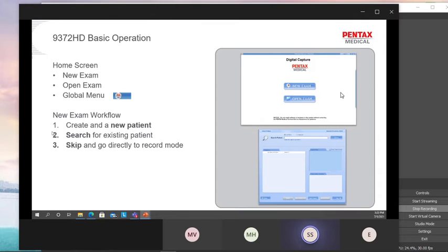Usually for service personnel with the old system, we would just create a test file. Over the years, you'll find a lot of test 1, test 2, test 3, test 4, and the entire system looks a bit messy because there are a lot of test files.